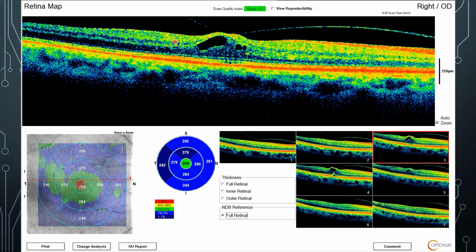What I wanted to show by this picture is you'll see that there is a little something here that's hooked. This is where the fovea was, but it's being pulled up and cavities are forming, fluid-filled cavities are forming, because the vitreous is pulling away from the back wall of the eye, but it's strongly adhered to the fovea in this person, and so it's creating a swelling of tissue. And that can create a drop in vision to, say, 20/25, 20/30, 20/40.